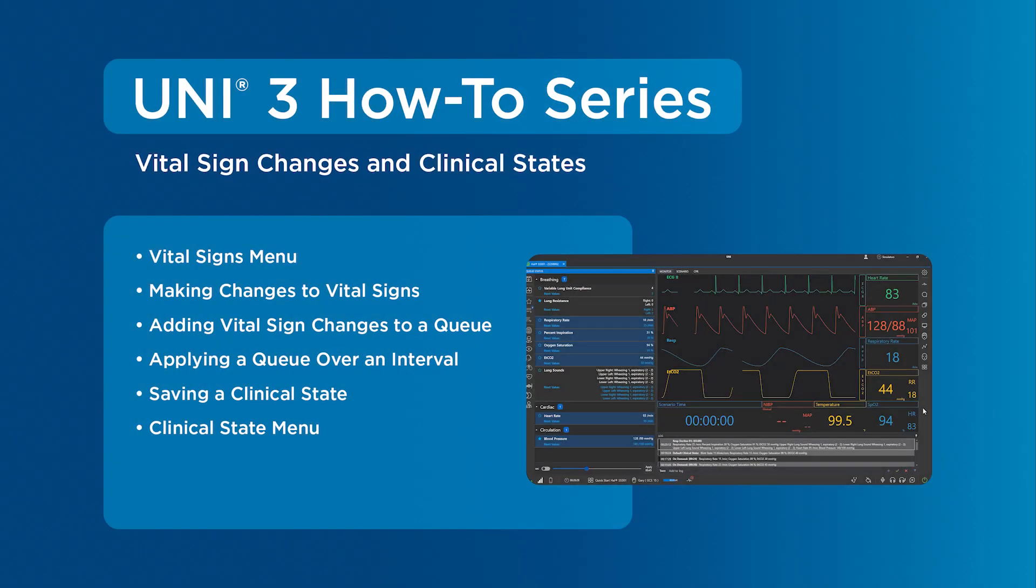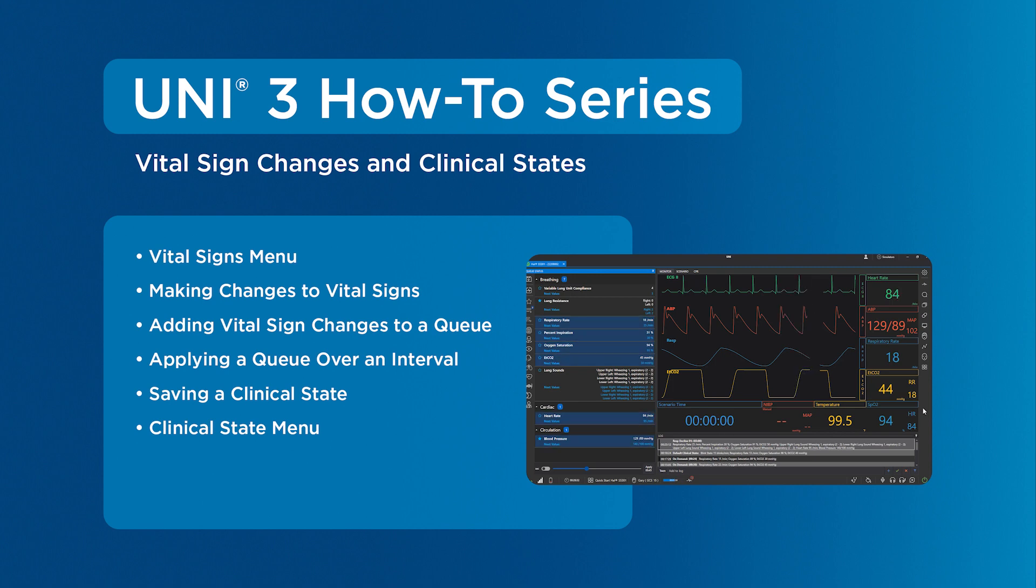This tutorial covers vital sign changes and clinical states for faster, smoother, on-the-fly operation and more realistic simulation experiences.